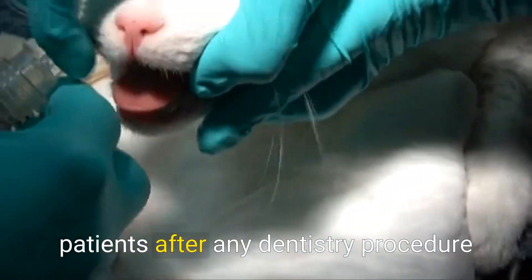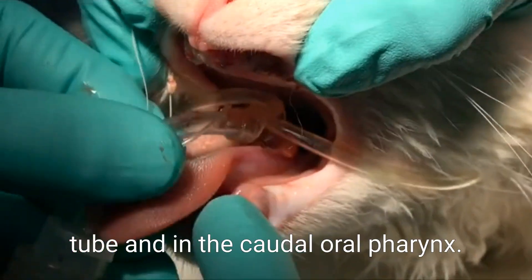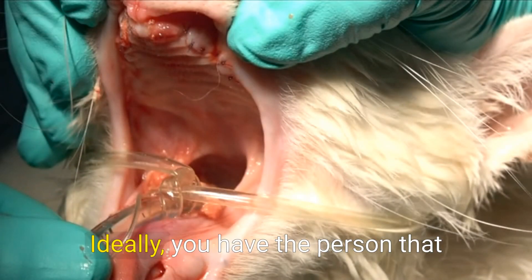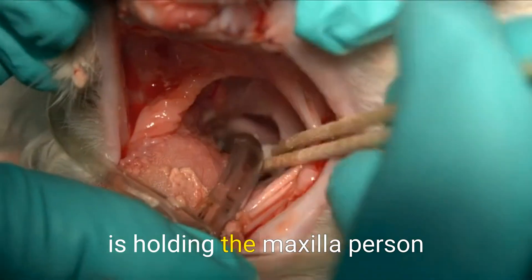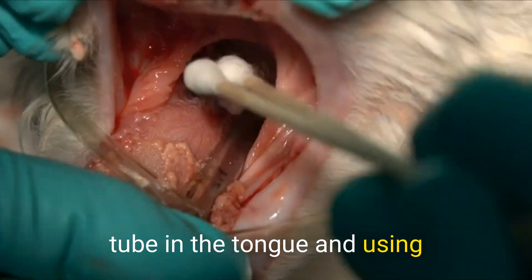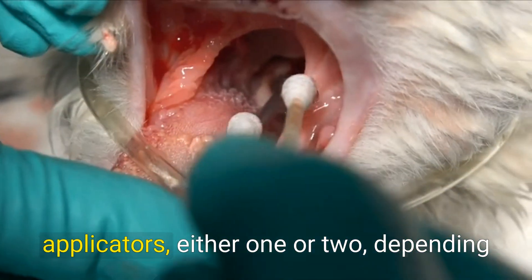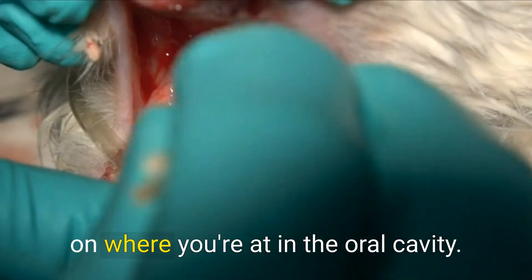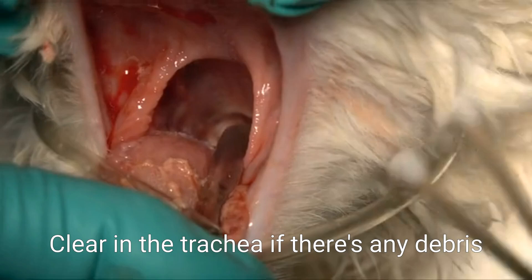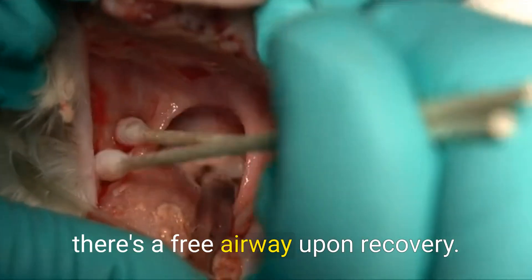One thing that we always do in our patients after any dentistry procedure is make sure that the airway is clear around that endotracheal tube and in the caudal oral pharynx. We position the patient in order to visualize that. Ideally, you have one person holding the maxilla, one person holding the endotracheal tube and tongue and using the cotton tip applicators, and someone else passing those applicators — one or two depending on where you're at in the oral cavity. This is absolutely critical: clear around the trachea, and clear in the trachea if there's any debris, to ensure a free airway upon recovery.